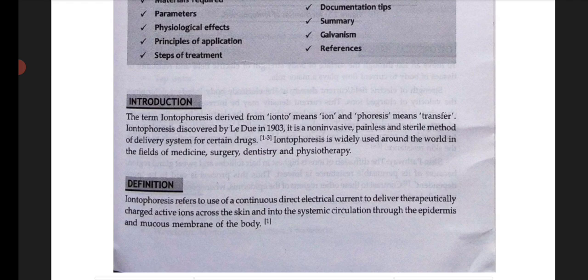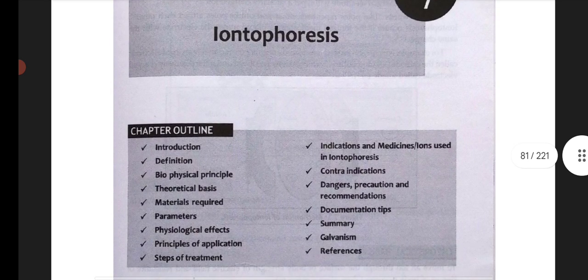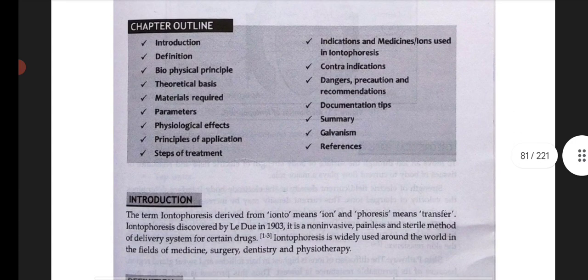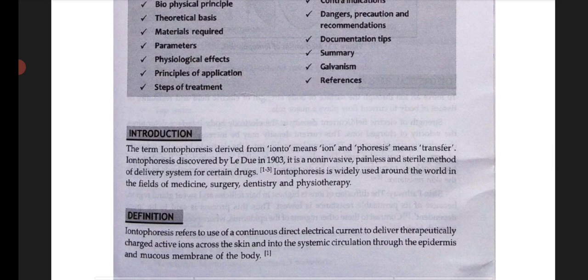Today we are going to study iontophoresis, one of the most important topics in electrotherapy. Iontophoresis. The word iontophoresis is divided into ionto and phoresis. Ionto means ion, and phoresis means the transfer of the ion.